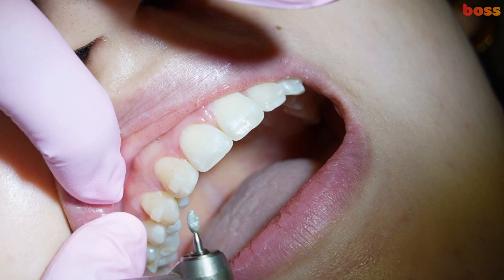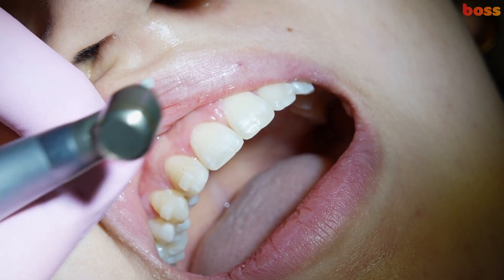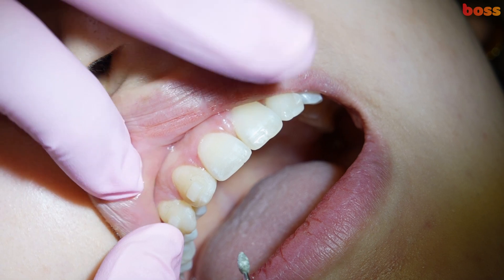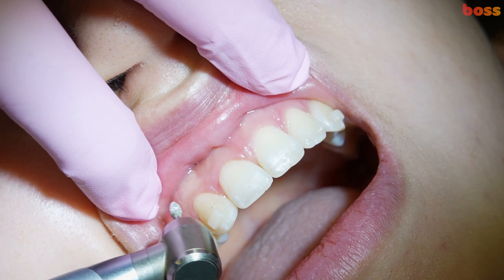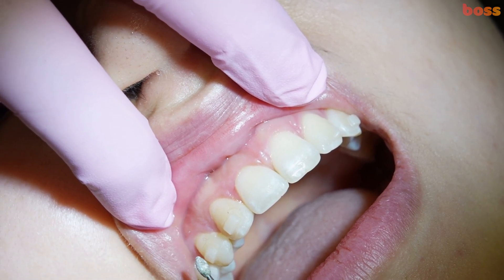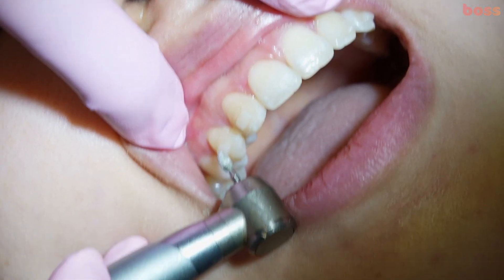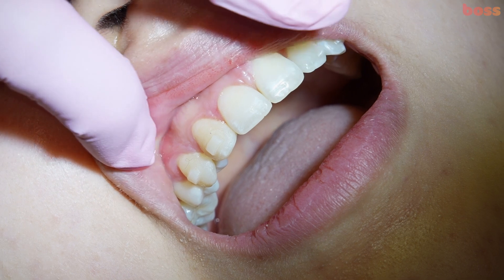We also want to do lingual root torque, because if you look at a lateral incisor, the root is often a little bit lingual. We don't want the root to buckle out on the canine — we want it to mimic the lateral. And a lot of times with this canine we might also do a bit of crown lengthening. So let's get started.